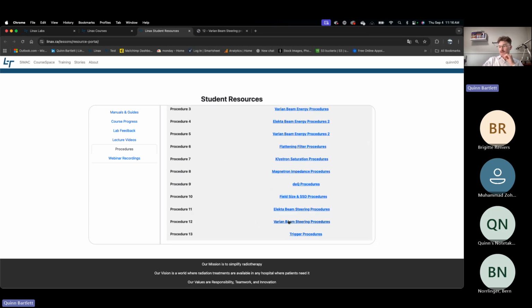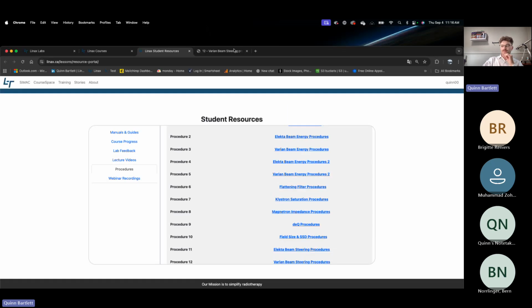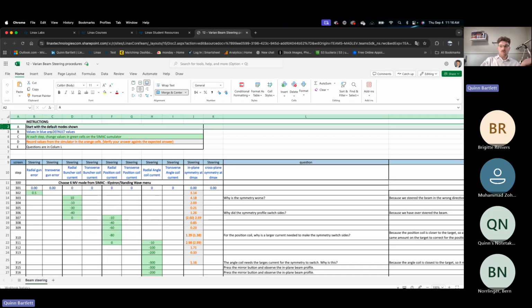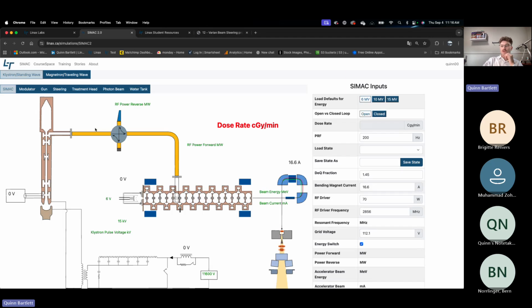And then you can see we have an Elekta beam steering procedure and a Varian beam steering procedure. And so what this looks like is it's an Excel form. And what it does is, it starts out with some instructions, and it'll say, start with the default mode shown. So in our first step here, we choose the 6MV mode from Simac Klystron standing wave menu, right? So just to show that, we would be in our Klystron standing wave.